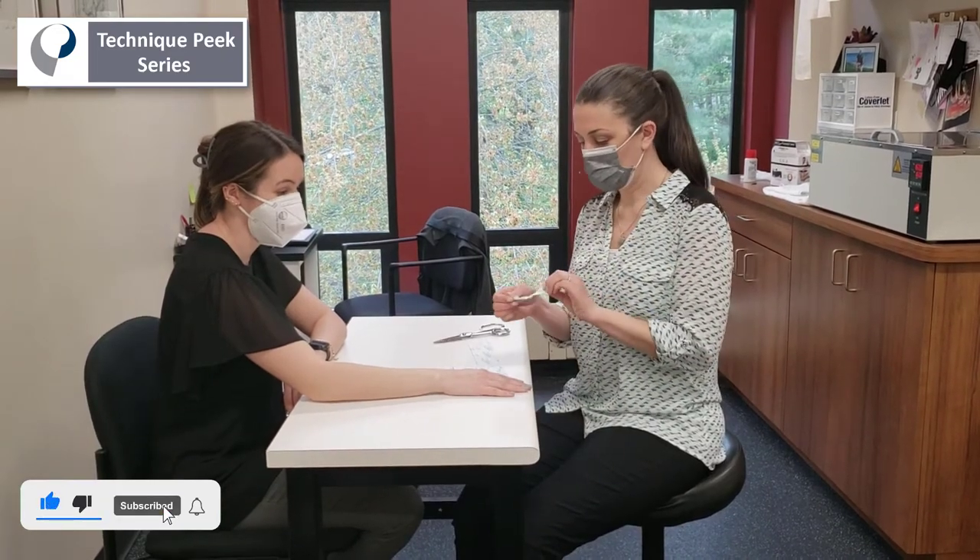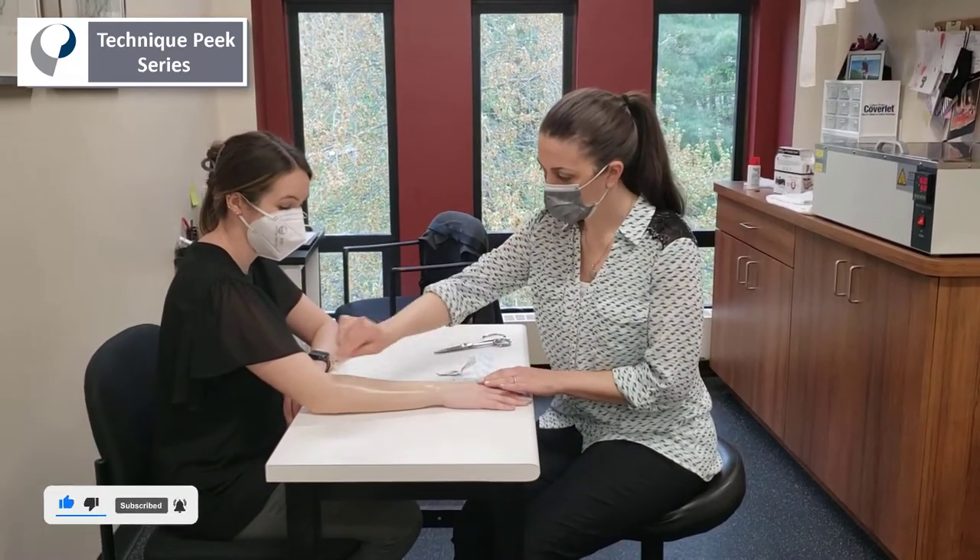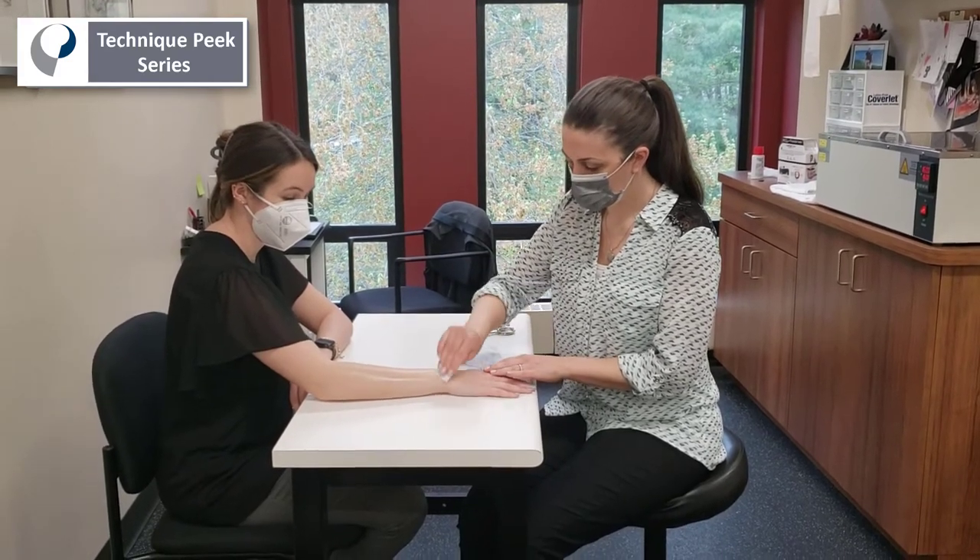We're going to start by prepping the skin with an alcohol swipe, just to get any lotions or oils off of the skin that might impede the sticking.